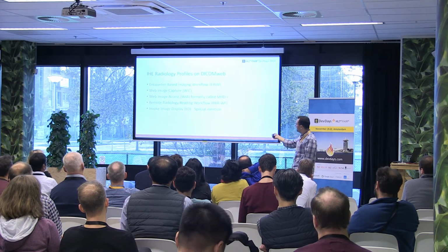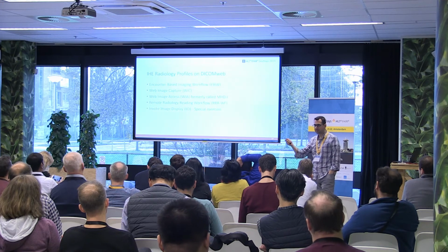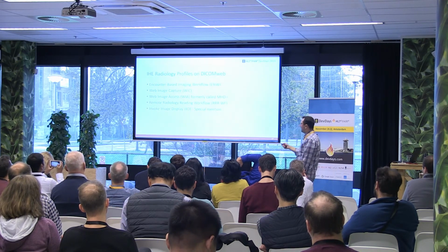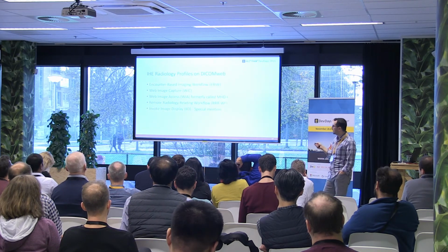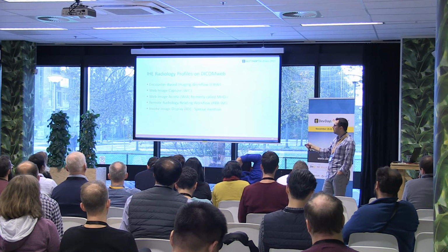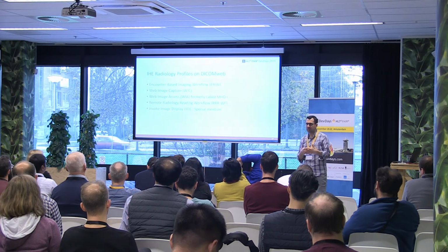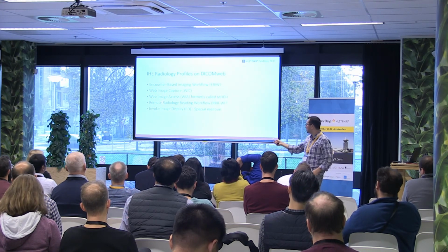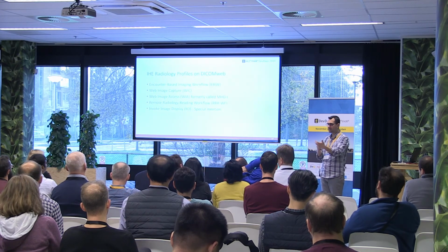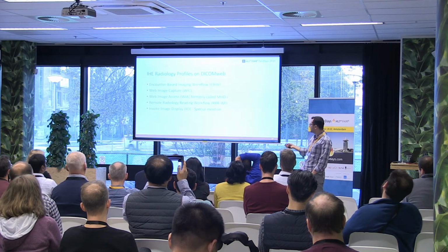Very quickly, a couple of things to think about as well. So I assume most people here know what IHE is. A couple of profiles that might be interesting. The first one is brand new that just came out, encounter-based imaging workflow. Web image capture has been out for a little while now, web image access. So these are profiles that just specify how you deal with specific workflows. So, web image capture is literally capture with a mobile device that's got nothing but a web browser, basically, and so on and so forth.